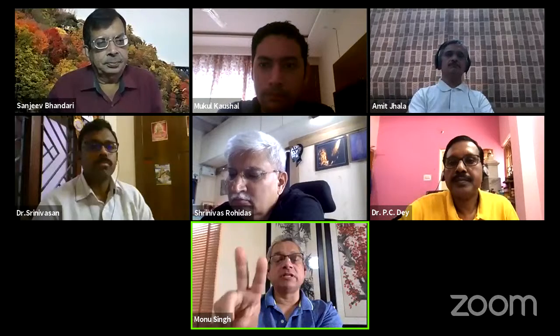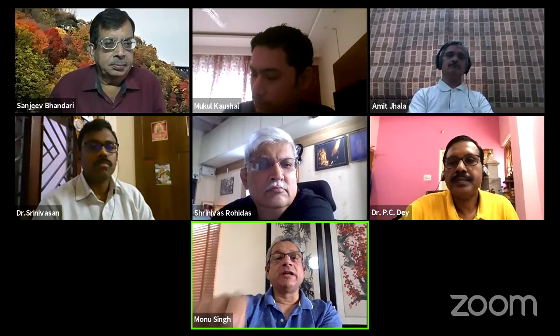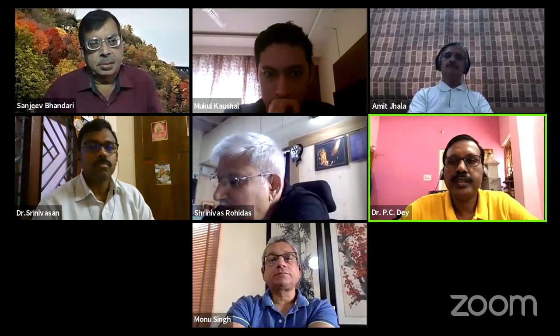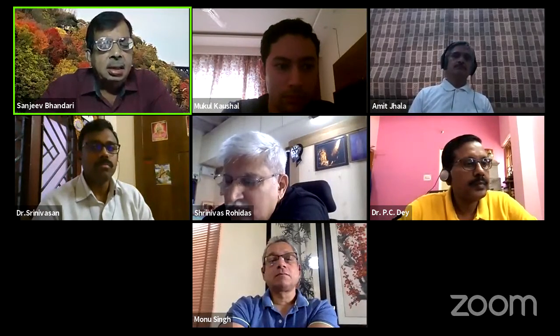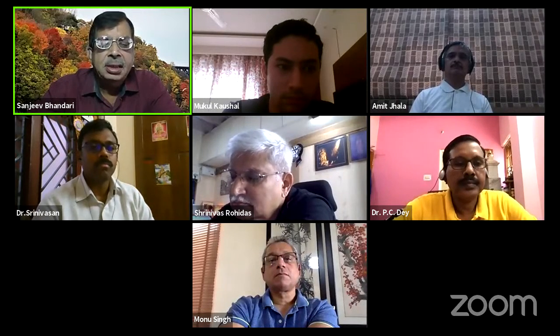And my second question is to the seniors here. If one has to do a prospective study, what should be the design of that study to be able to understand exactly how efficient this Destandau system is in a particular set of patients? So these two questions. One is for the general. I think Dr. Bhandari, we will have a very good discussion onwards, and Rohidas is going to speak on this topic. So you can conclude within one sentence, Dr. Bhandari. Please answer him. Yeah, only one sentence. Probably the earlier learning curve, some dural tears and some neuralgia, and secondly, the discitis problem in two patients, where the patient suffered a lot for about 2 to 3 months. These were the patients who were not happy. Otherwise, no permanent damage has been seen, and of course, recurrence in a few cases.